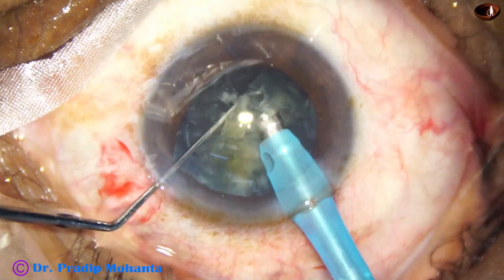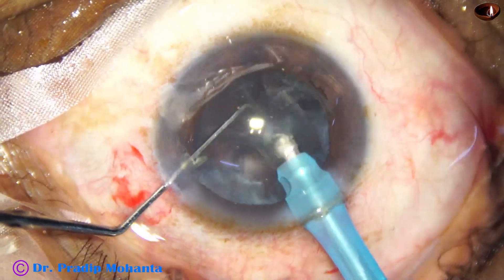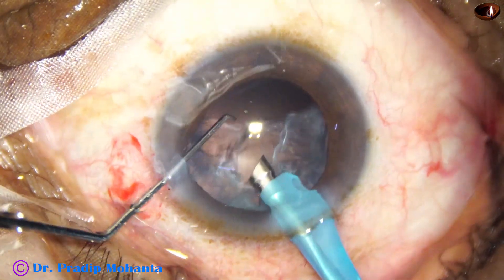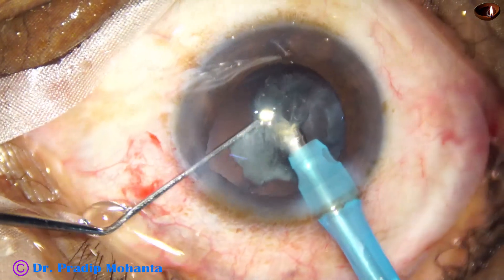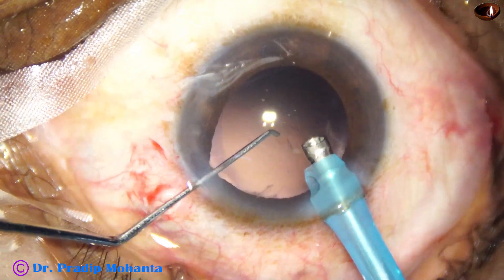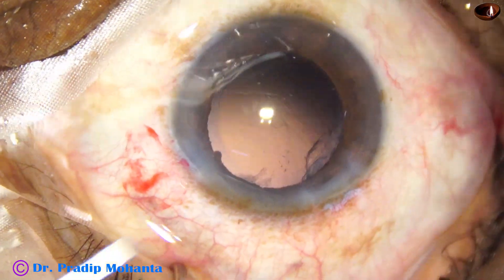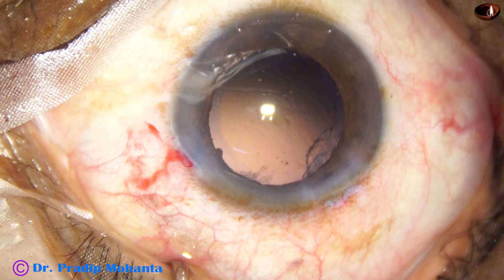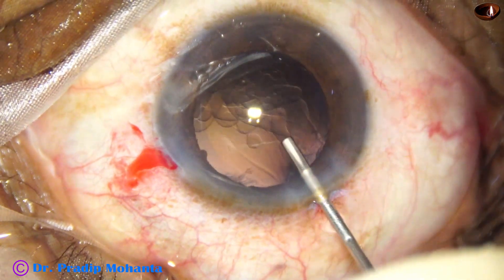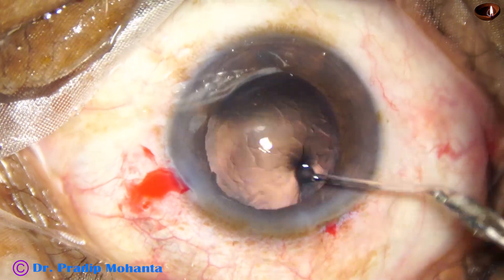This is the last part of the nucleus. Now we go to lower vacuum and remove the epinuclear shell — at this time the ultrasonic energy is only 30 percent, flow rate is 30, and vacuum is 300. Earlier, while doing the submarine chop technique, the vacuum was 480 mmHg, flow rate was 48, and ultrasonic energy was high at about 80 percent.